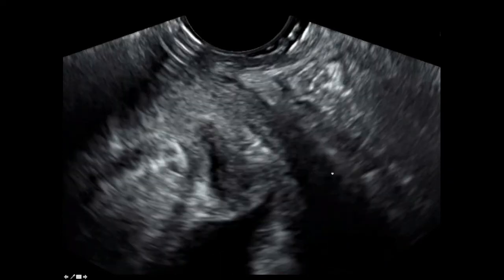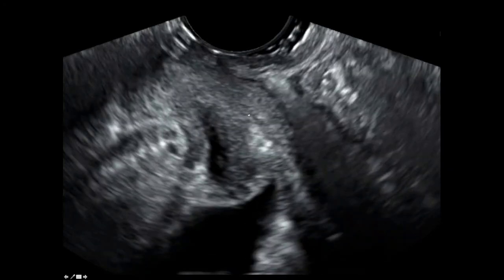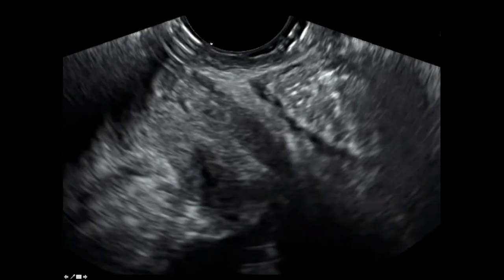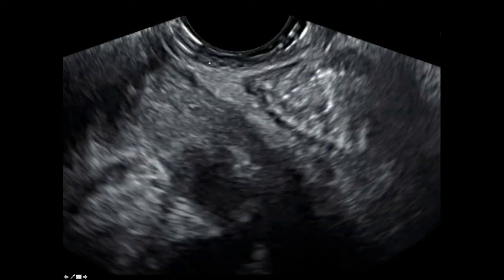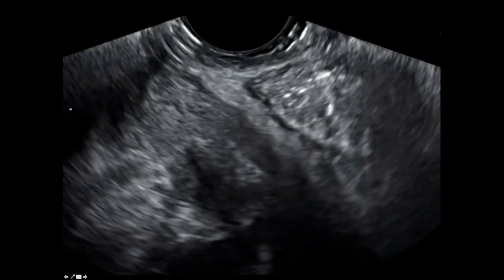And what's coming down? It's a small bowel. This is an enterocele, which means that when she valsalvas, it's the small bowel that's actually coming out into the vagina and into a pouch there. So this is much more rare, but obviously the fix is very different than if it were a rectocele.